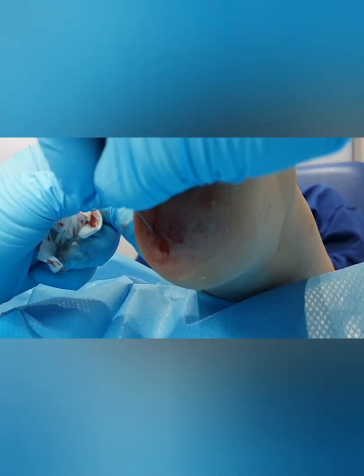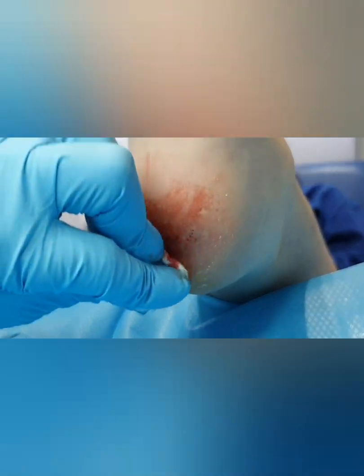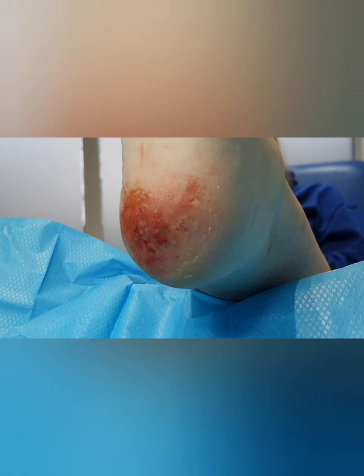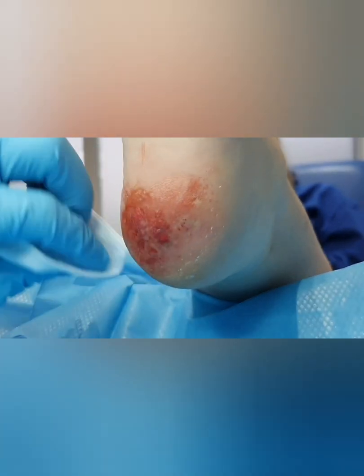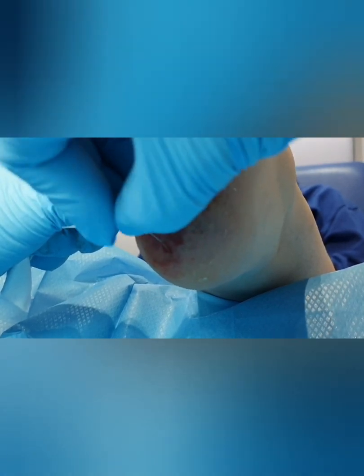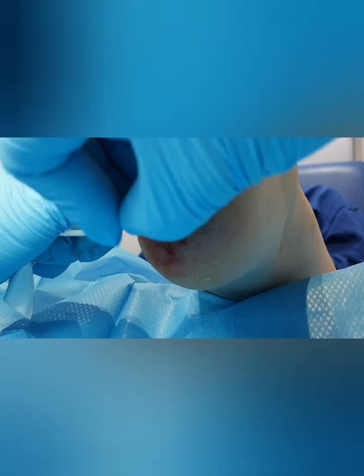So those immune cells are then like, hang on a minute, I'm going to deal with you and I'm going to sort you out. Now, this lady has obviously these verrucas on her heel, but she also has some further up her foot near her little toes on the sole of her foot. Now, we wouldn't treat all of the verrucas. That's not the idea with this. The idea is to initiate this immune response, to get this immune system working.